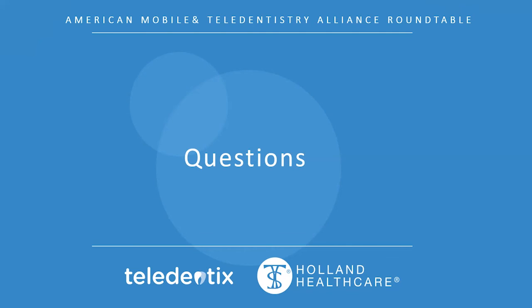So I love Teledentix, and I got my new kit in the mail, and my new case for the phone, and I'm going to be going out using it more often. But to me, the biggest advantage, and this always gets me in trouble, is the fact that it's on the phone and it's easy. When Melissa asked what the advantages were, the biggest advantage to me is it's on the phone. Most people have their phone with them, and there are no cords, no strings, nothing to hook up. You just turn your phone on and go. That just makes my whole world happy. So I wanted to add that in.